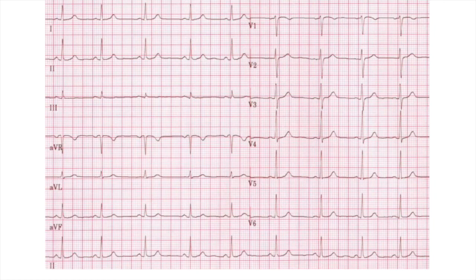So rate, personally I would go at rhythm first here. So there's roughly 1, 2, 3, 4, a bit more than 4. I would say this is roughly normal sinus rhythm. Because it's around 4 squares in my head, 300 over 4, about 75, exactly 75 beats per minute. So we've got rate and rhythm straight off the bat. At this point, I would usually describe any obvious abnormality. I can't actually see any, but then again, I'm only fifth year.